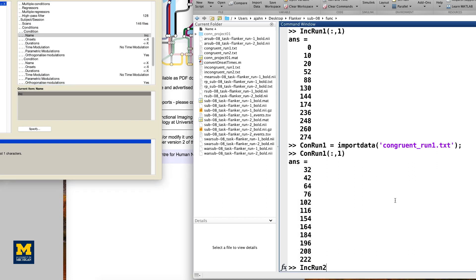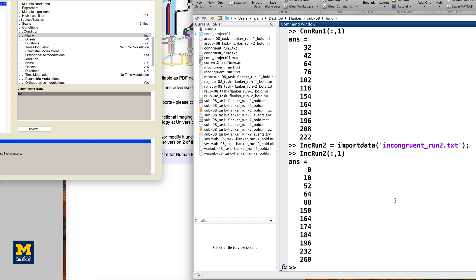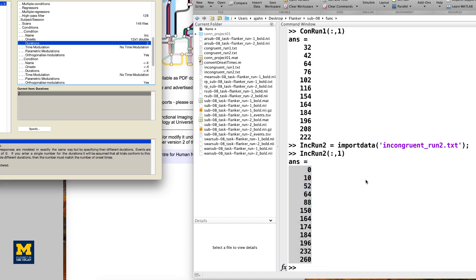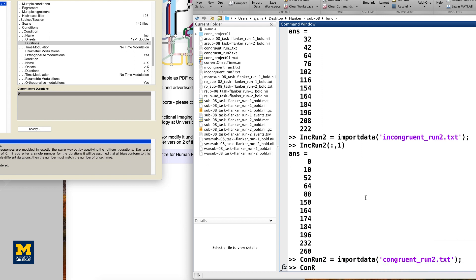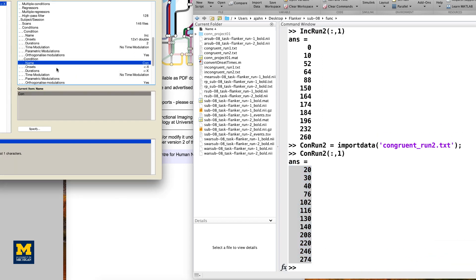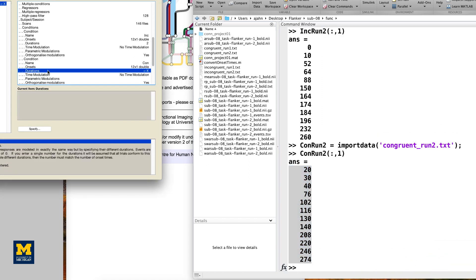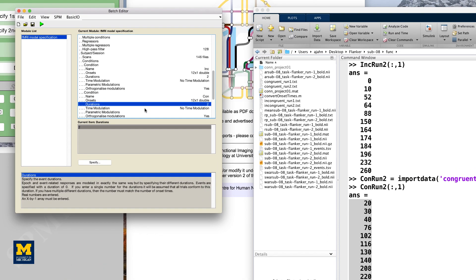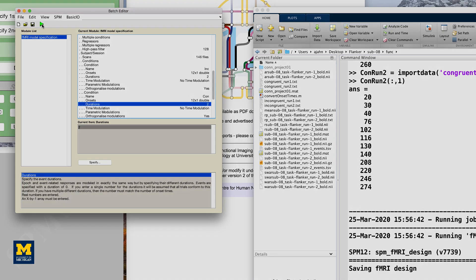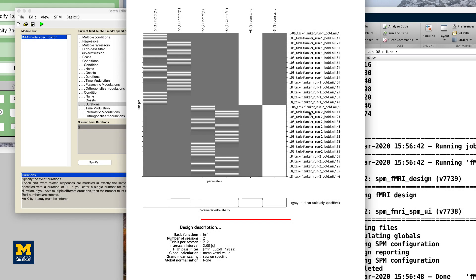Here, I'm typing the code that you'll need to display the onset times for each of the remaining conditions. When you are done, click the green Go button. The model estimation should only take a few moments. When it is finished, you should see something like this.